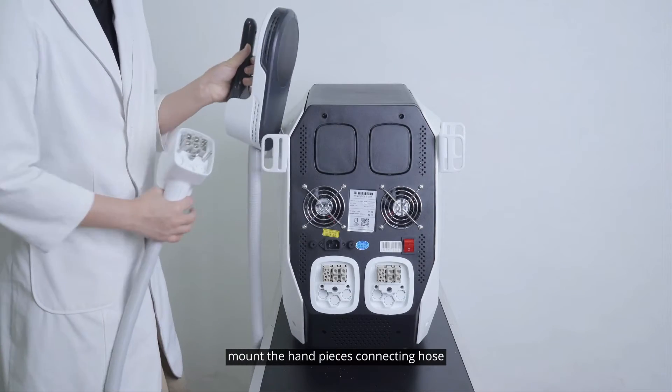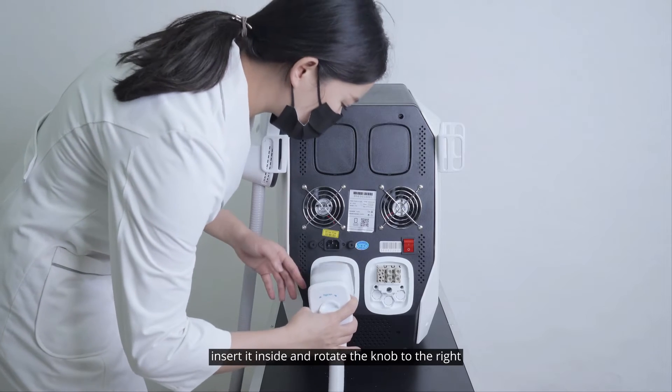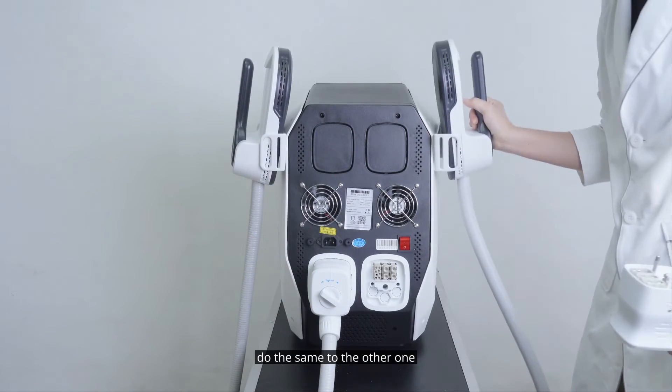Mount the handpiece connecting hose, align it with the socket in the back, insert it inside and rotate the knob to the right. Do the same to the other one.